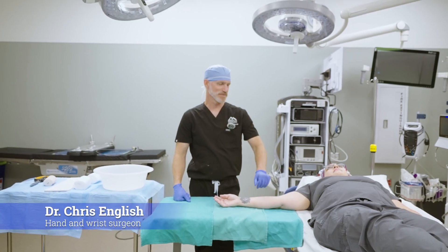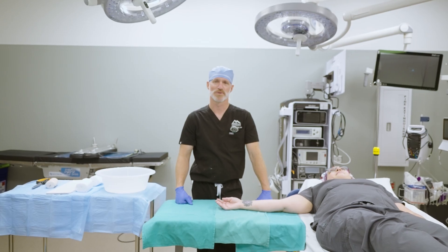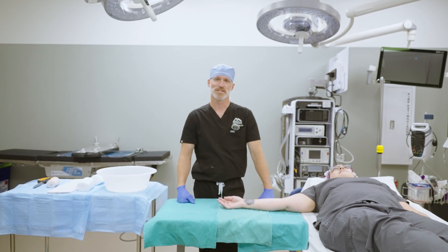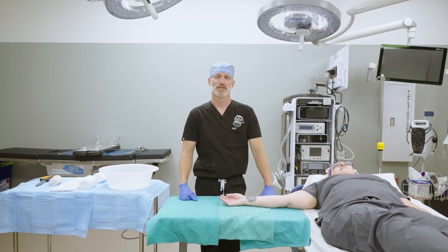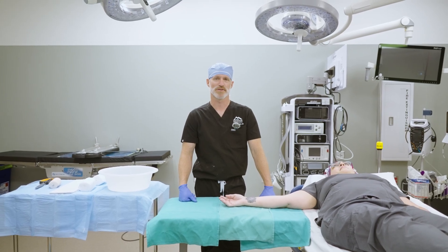Hi, I'm Dr. Chris English. This is my assistant Jen, and I'm going to be showing you how to put on a thumb spica splint for post-operative care of a patient. This is a splint that I use after a CMC arthroplasty, after a tendon repair, or a fracture repair on the thumb.